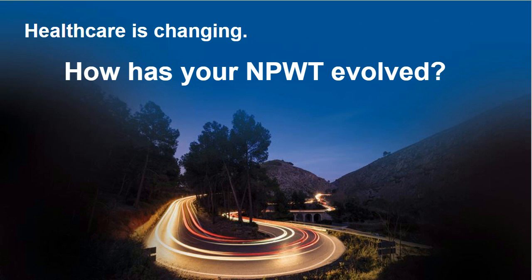Well, yeah, you have that chronic wound fluid sitting there, and you have more dynamic cycles going through in that 2 hours. So it does make a difference. And if I'm not mistaken, with negative pressure wound therapy, if you lose vacuum for 2 hours, or if you have to shut a device off, most systems, and I know ours, require you to remove the dressing, because a 2-hour window without vacuum can lead to challenges because of the risks of maintaining that sealed environment, and the wound exudate perhaps pooling in the wound can create negative effects on the wound.